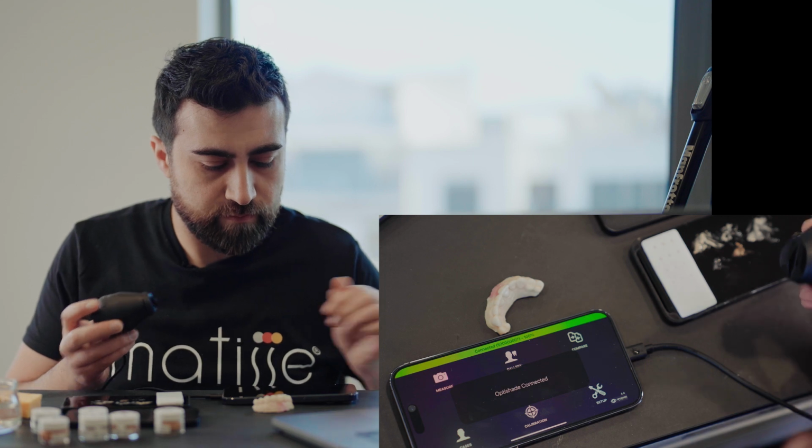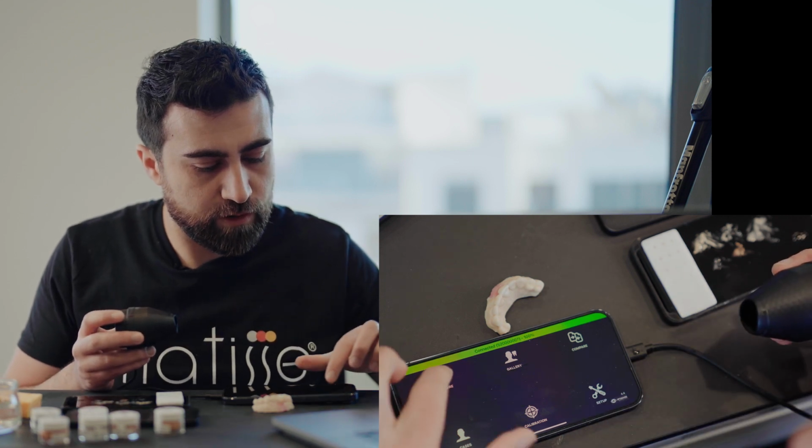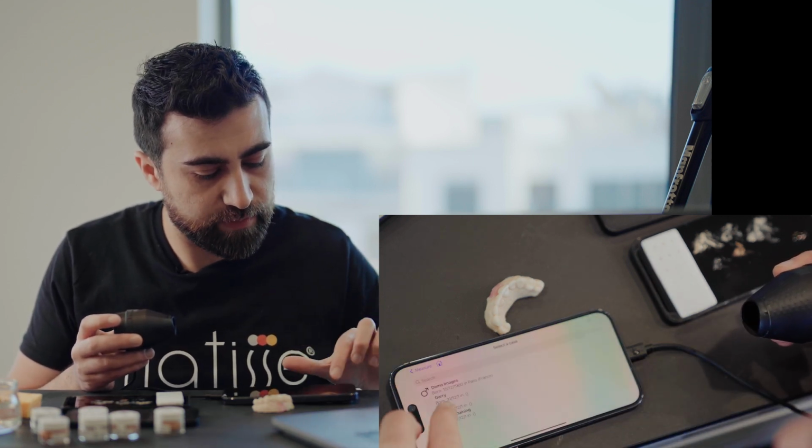So let's switch Optishade on. Go to measure, select the patient.